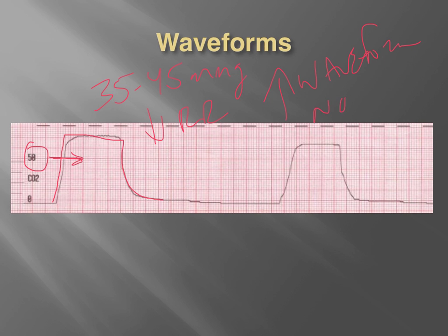even though it's normal. So we know the patient's exhaling properly, and being that we have a lot of carbon dioxide being expelled, we can deduce that most likely, with the waveform nice and normal and square, and the exhalation of carbon dioxide this high in levels, this patient is hypoventilating by respiratory rate only, and they actually have good tidal volume.